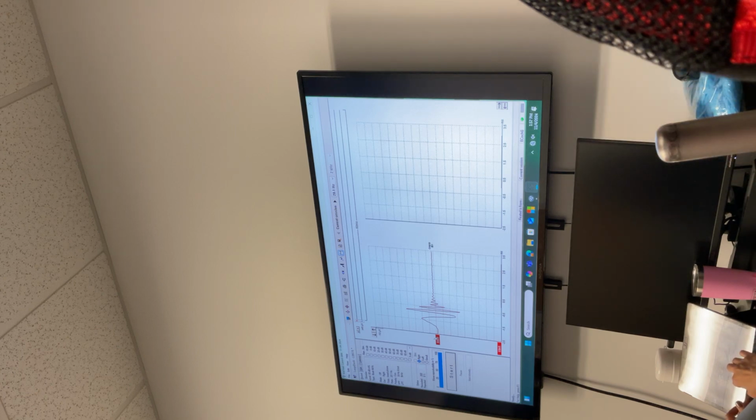Again, the chirp stimuli are developed by accounting for the traveling wave delay, which has been shown to result in larger amplitude because of synchronized neural activity. The response amplitudes are larger, you need fewer sweeps, and the thresholds are a little lower than tone burst. On average, it's said to be 5 decibels lower. We don't have a lot of data on that. Okay. So this is broadband chirp. You can see there's still some energy going on before, okay?